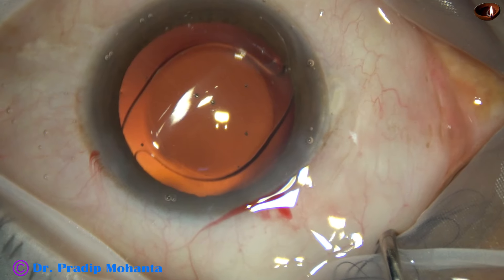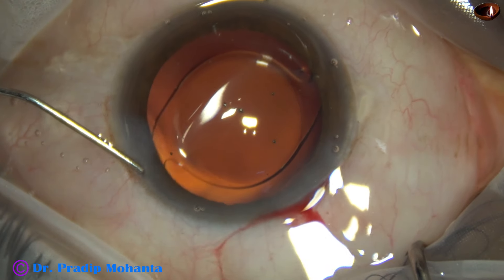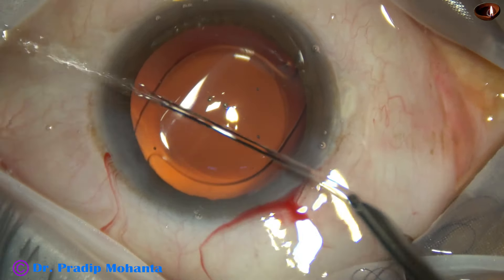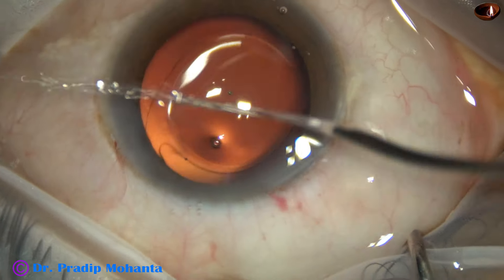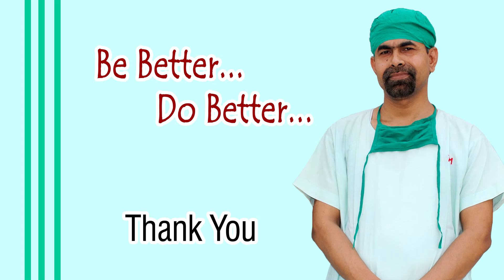This is a bit of moxifloxacin. Now the side port is closed by stromal hydration, and this is the final lavage of the anterior chamber. The chamber is nicely formed and the case is concluded. Thank you very much for your attention. Hope this video will help you in developing your surgical skills. Be a great surgeon and serve your patients with love, respect, empathy, and great surgical competence.